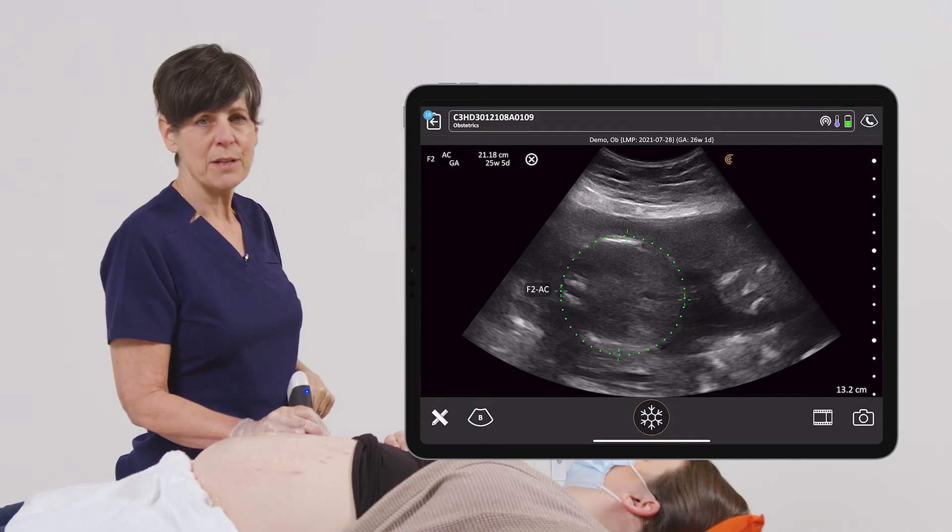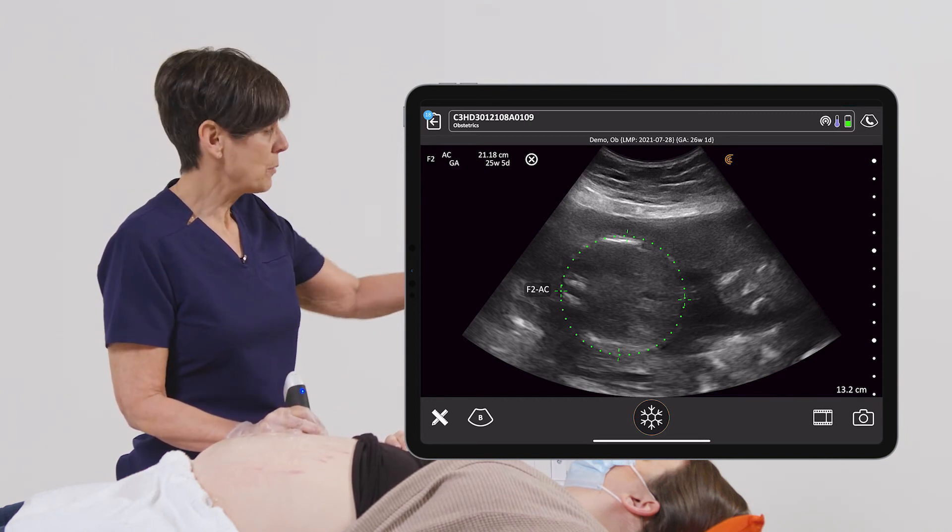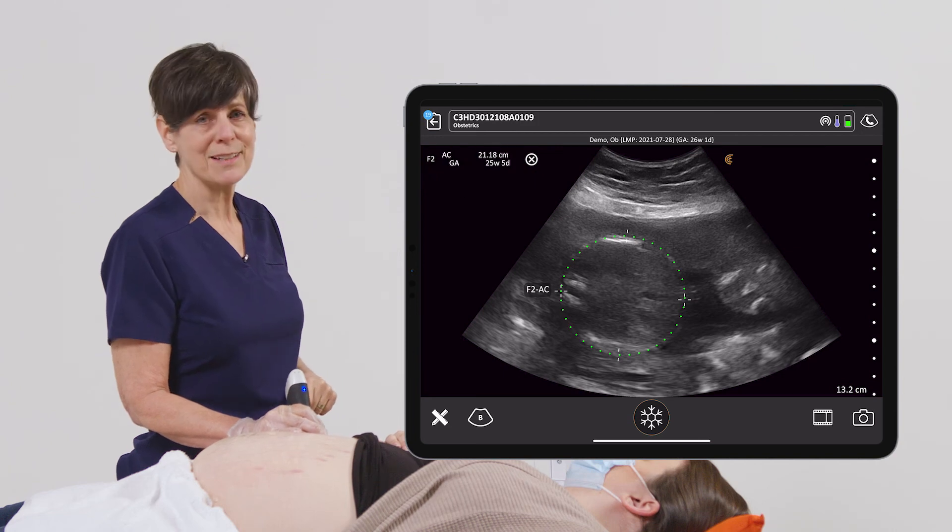This is showing me 25 weeks and 5 days, which is well within normal limits. So I'm going to save this image to the report and we'll move on to the next measurement.